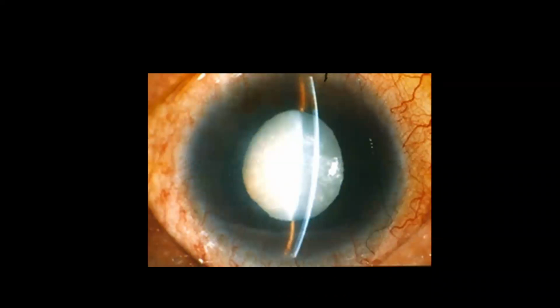So now that's the picture of the patient after you lowered the intraocular pressure and did PI. And now the eye is quiet after 1 week and the patient is happy. What will you do for the patient? You did B-scan and the B-scan is normal. What kind of surgery will you do for the patient? We will go for cataract extraction.